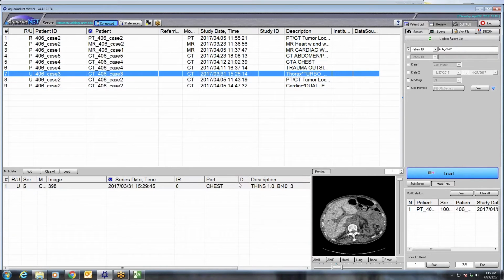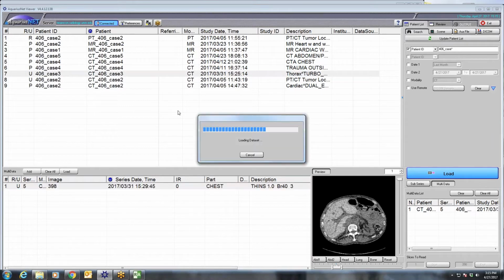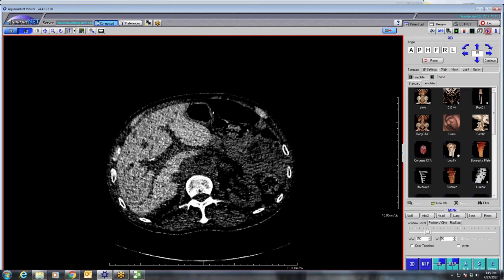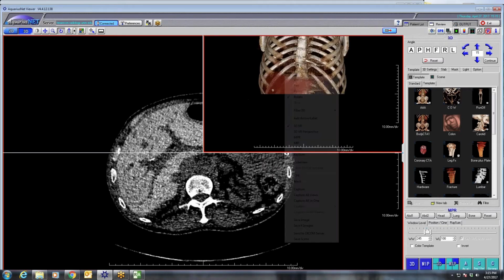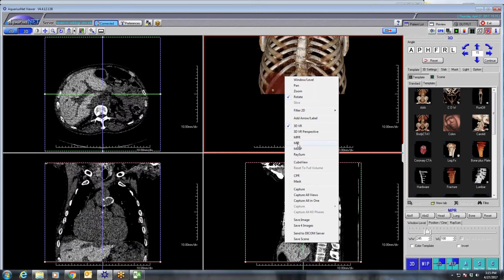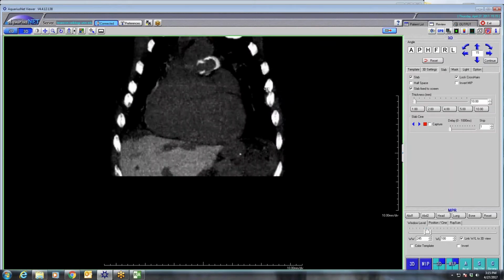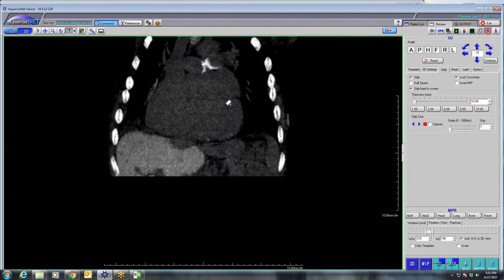And then the last case is not that exciting, but it's just a very pretty case of one of the denser livers I've ever seen from amiodarone on a non-con. Again, thin slices kind of ruin it a little bit, but this is an amiodarone liver with, let's see if I can do a little MIP here. See how impressively bright this liver is on the non-con.